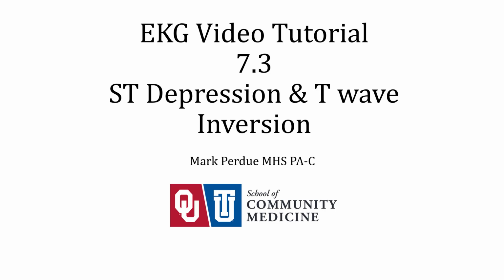This is the last video in the 7.0 series. In this video, we're going to look at ST segment depression and T-wave inversion that are associated with ischemia as well as other potential causes.